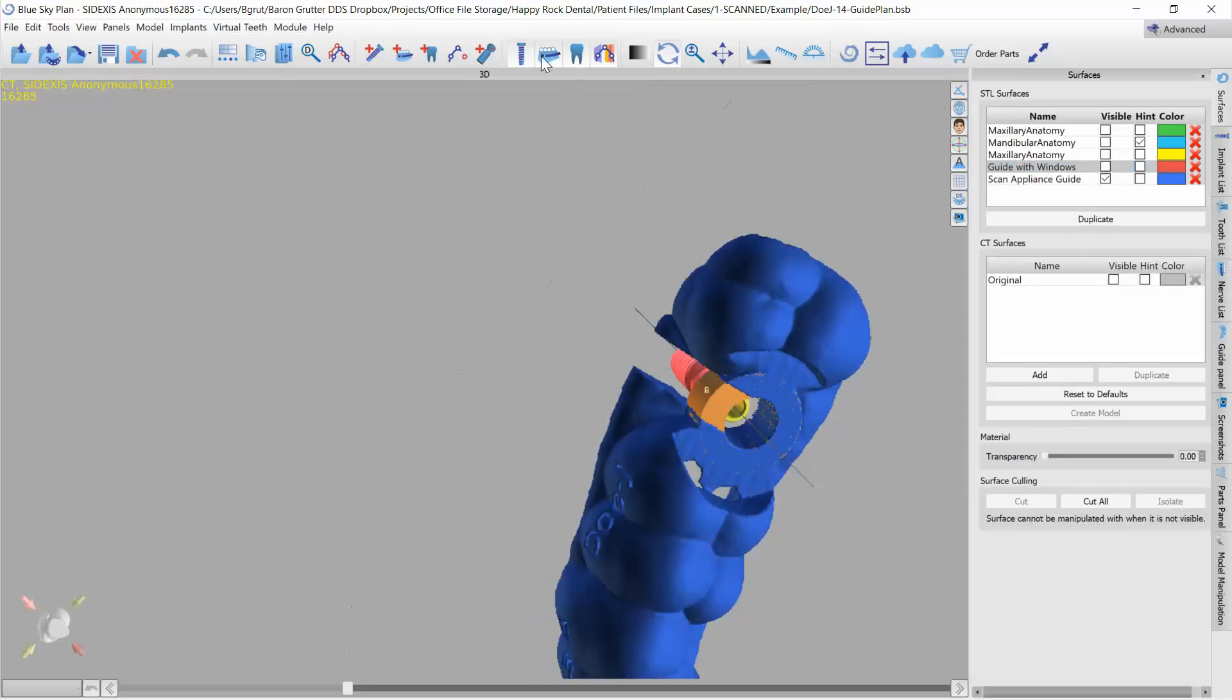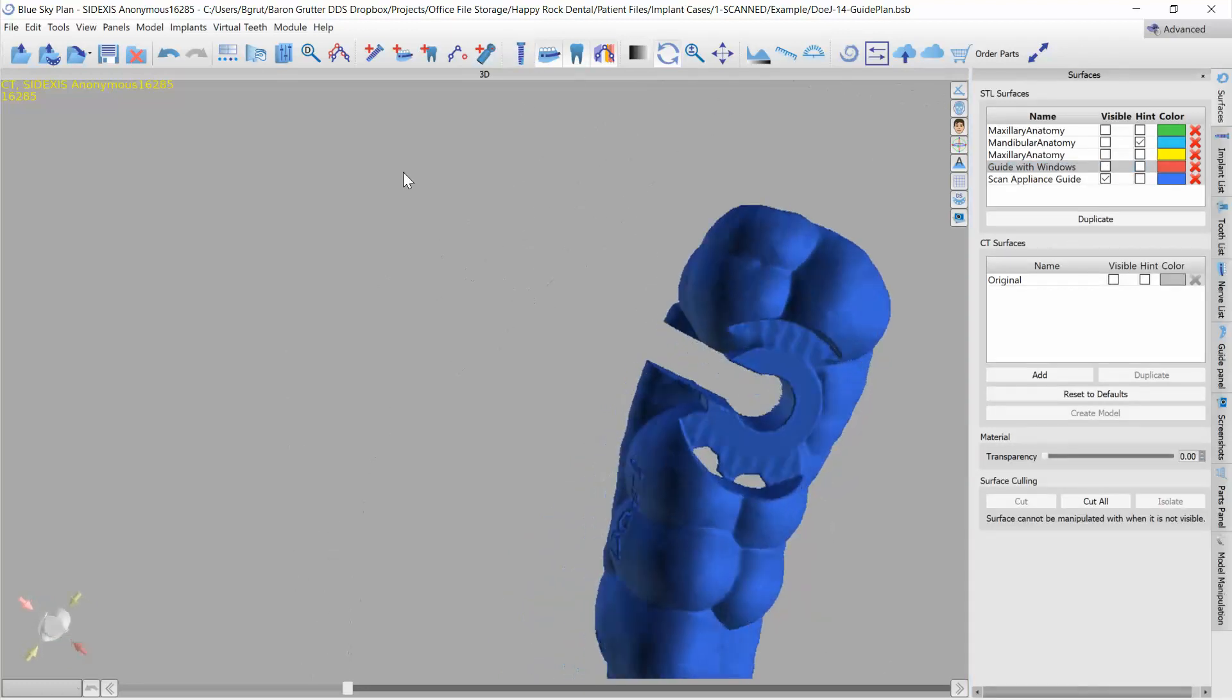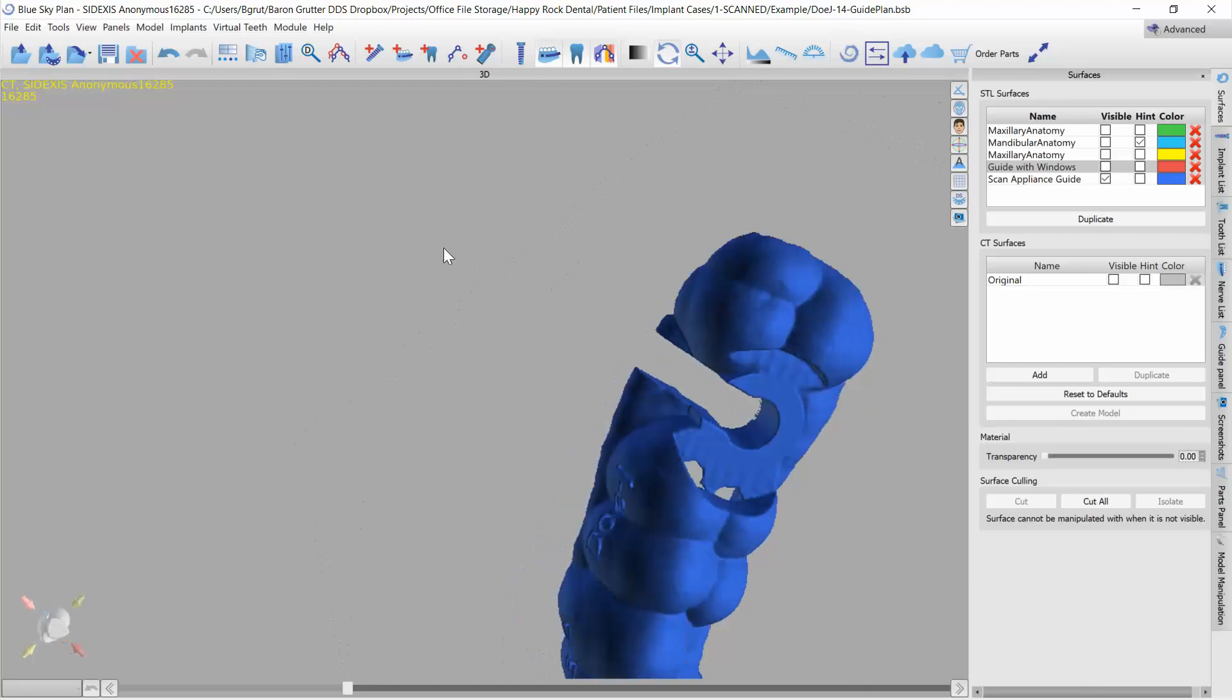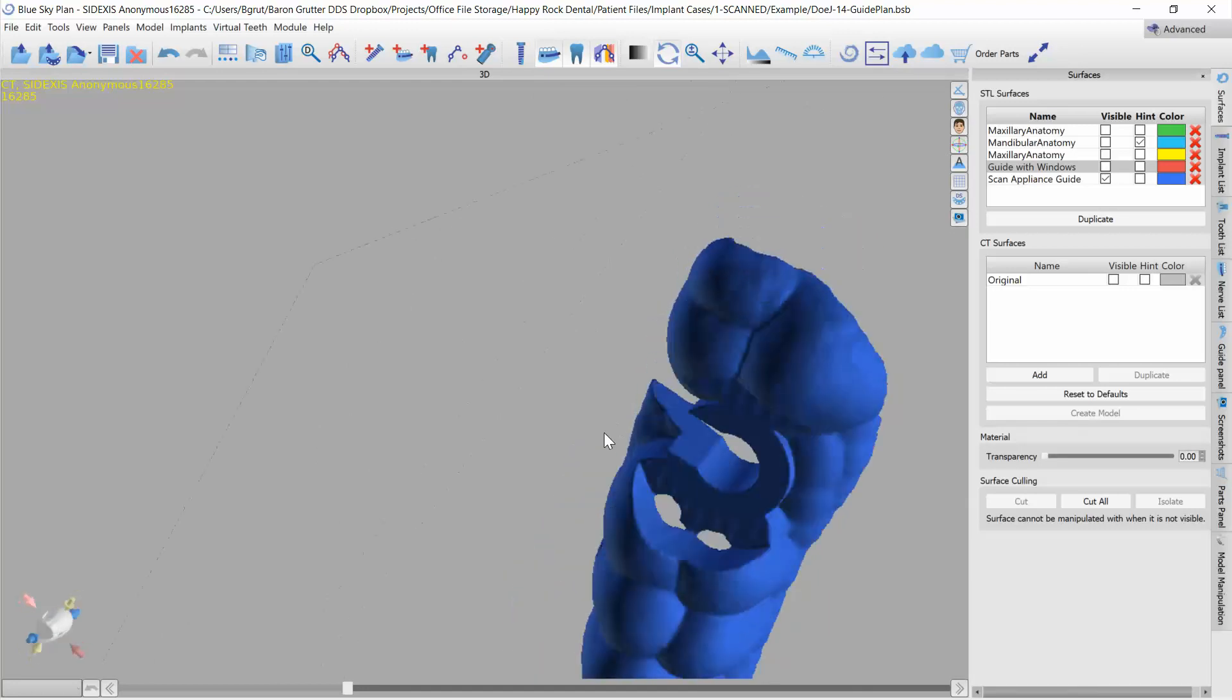Okay, so now let me hide the implant. Here is my guide. I can export that, I can print that.